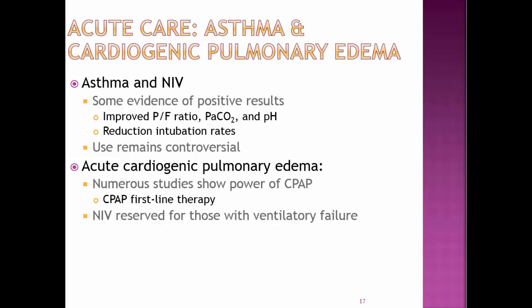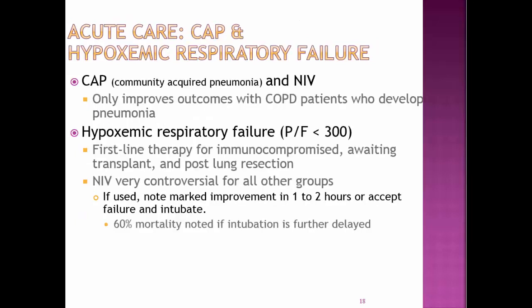Acute cardiogenic pulmonary edema. Numerous studies show the power of the CPAP, and CPAP is the first line of therapy here. Non-invasive ventilation reserved for those with ventilatory failure. Community-acquired pneumonia.